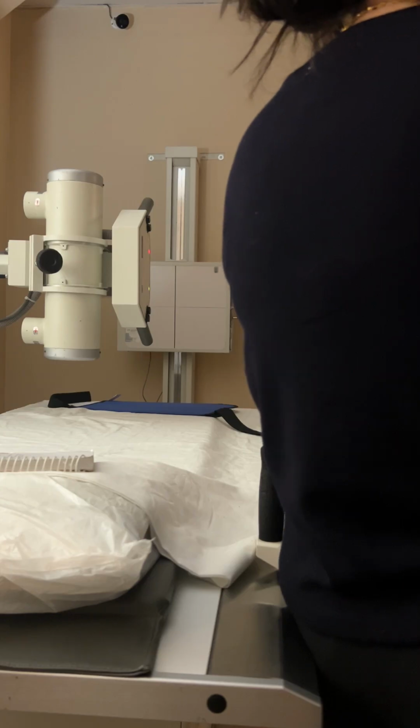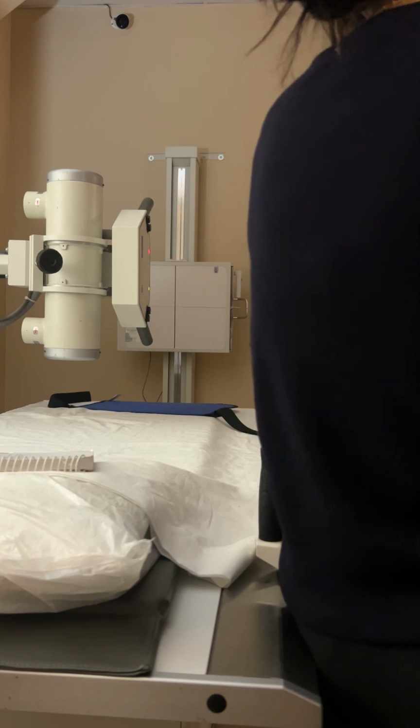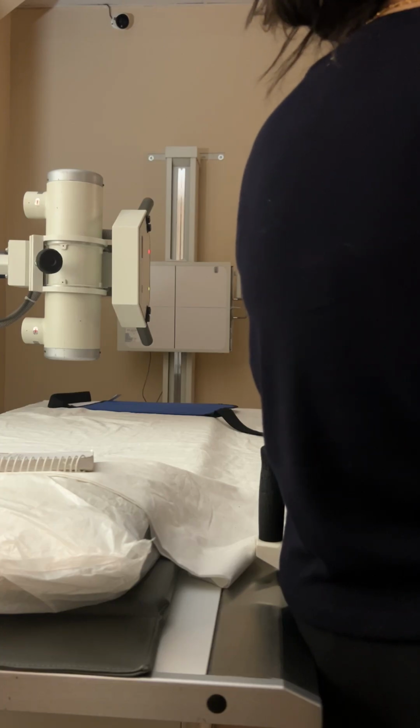If they can't remove it, you're gonna ask them. They can remove it if they have. I gotta see if I can get that lined up more. You're good, I think you're detented. I just think this x-ray tube is way out of alignment.